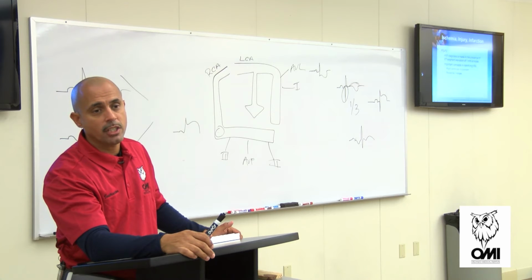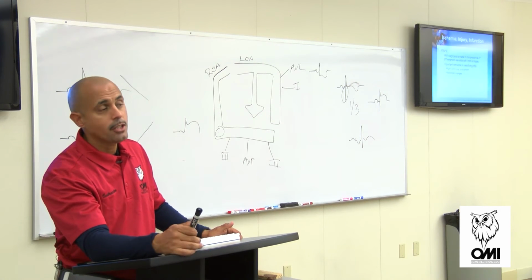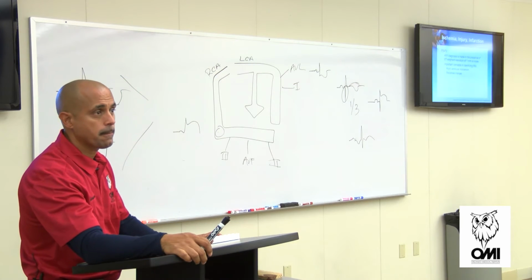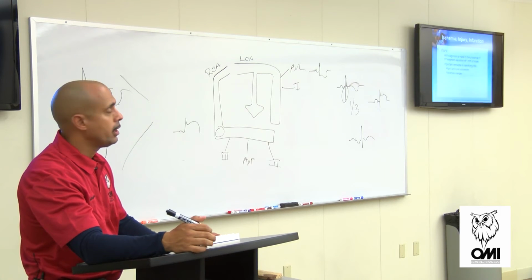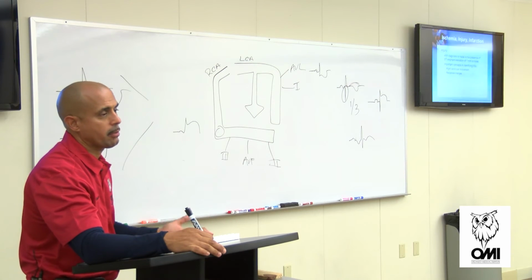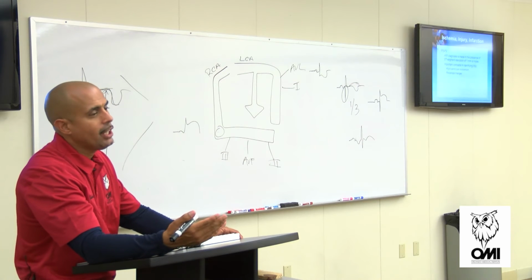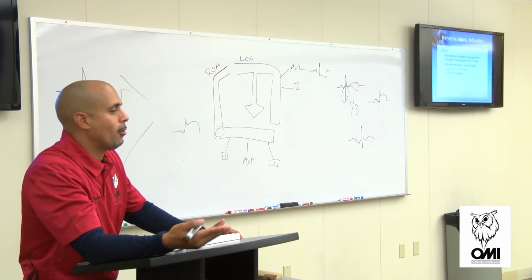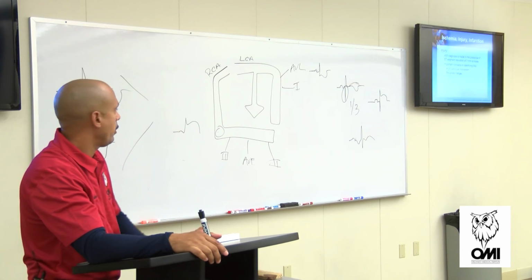Yep, and if I have elevation, then that septal wall was true reciprocal changes. So that's a true posterior wall MI. Make sense? So it's just to consider it extending. You have to have both sides to confirm it. No. You call it ST, but if you question it, reciprocal. But all ST elevation that are injured will have reciprocal change outside. So you should always get in the habit of looking for reciprocal changes to confirm. All it is is confirmation. You should know how to read ECG, but it's just confirmation. All right?